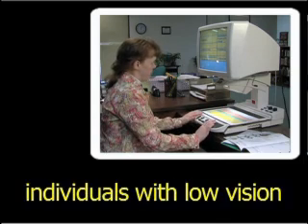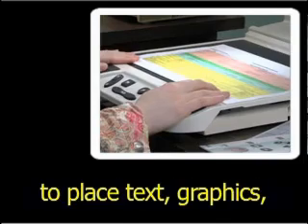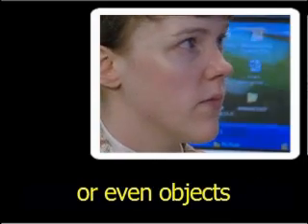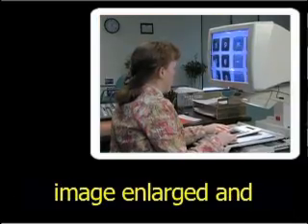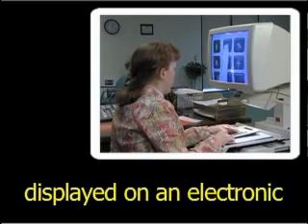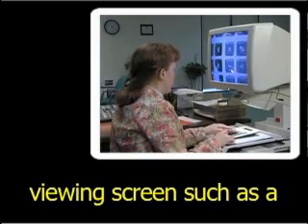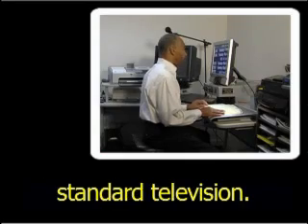Video magnifiers allow individuals with low vision to place text, graphics, or even objects under a video camera and then have the selected image enlarged and displayed on an electronic viewing screen such as a computer monitor or standard television.